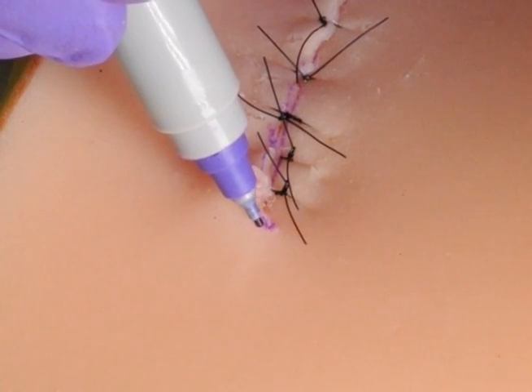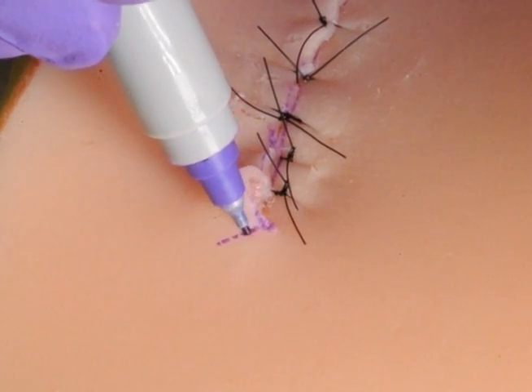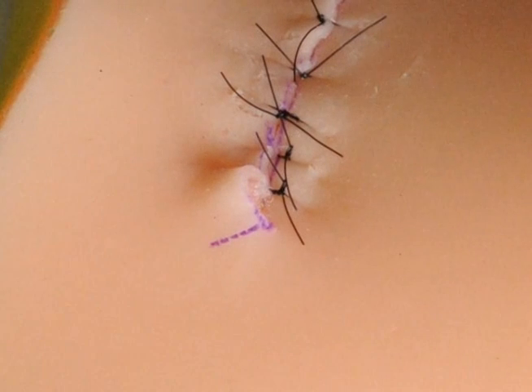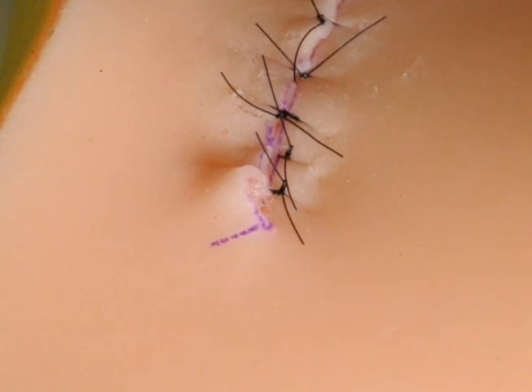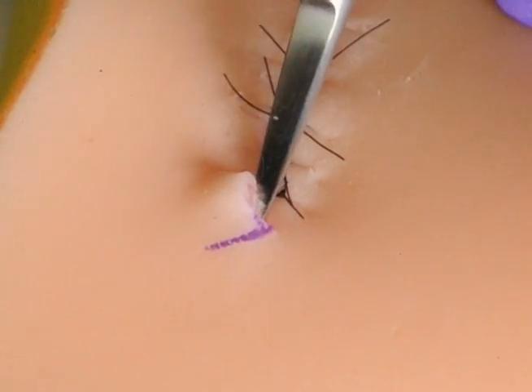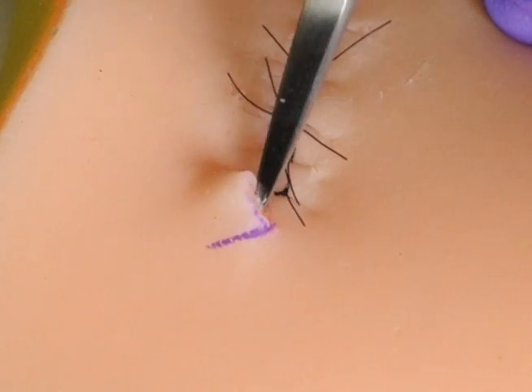To repair a dog ear defect, you first extend a line out 45 degrees from the wound, going towards the side with the dog ear. Once you have marked the skin, you undermine the area beneath the dog ear.